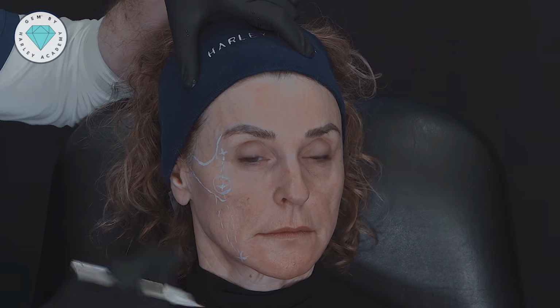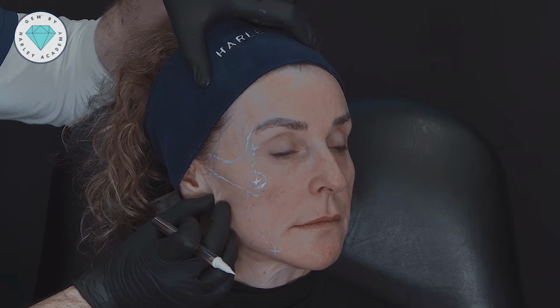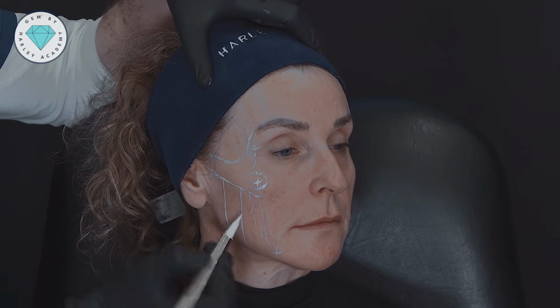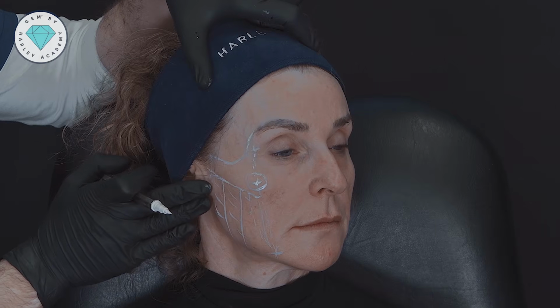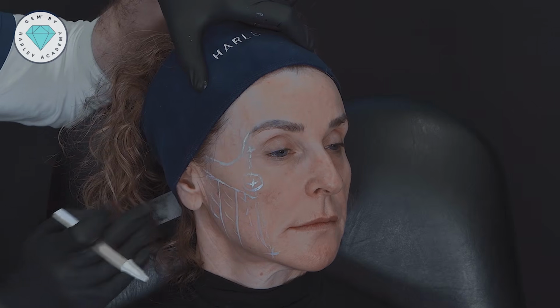Treatment number three is going to be the area behind the line of ligaments underneath the zygomatic bone. This is our preauricular area. We have kind of preauricular, subzygomatic, submalar, if you divided this area into three sections. And all of this can be volumized with hyaluronic acid in layer 2. This is what's going to give a lot of this lovely definition and also tension laterally to the line of ligaments that's going to improve the jawline and the midface.